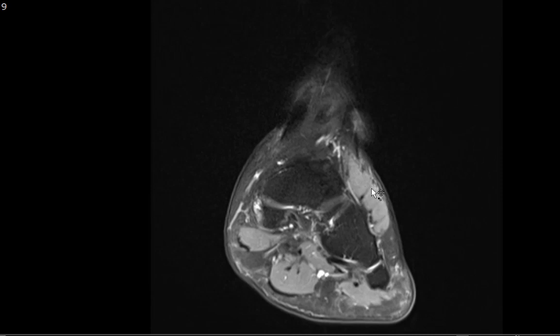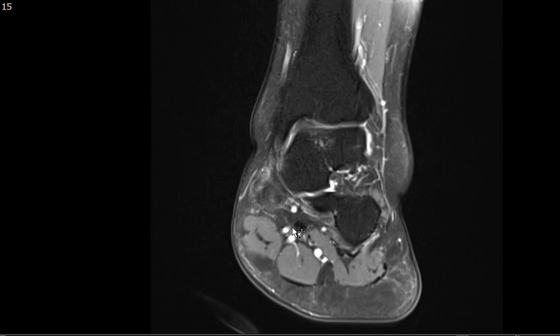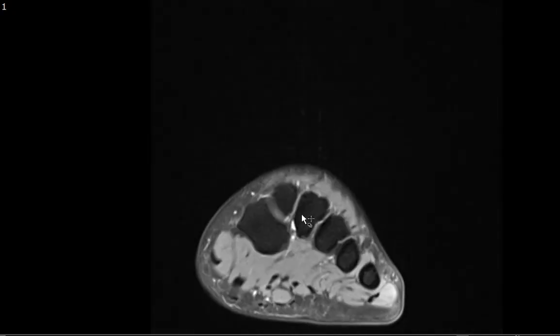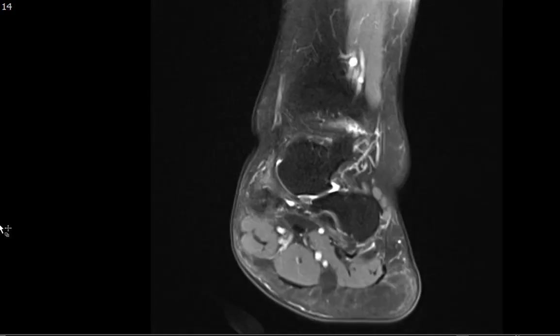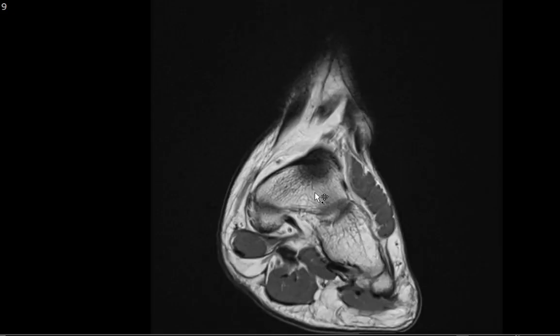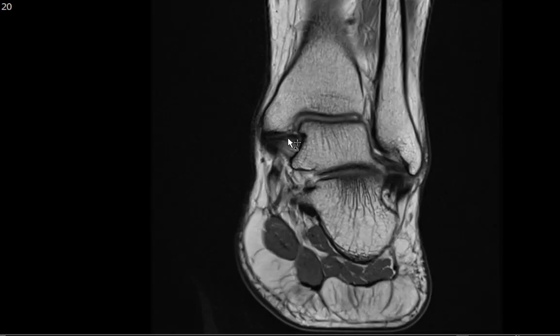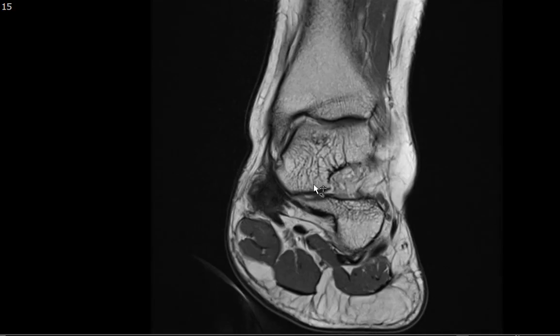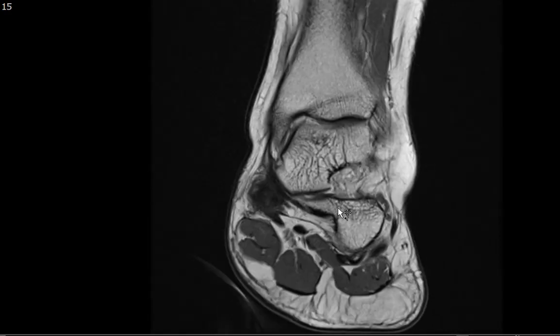On the coronal images you're also seeing the extensor digitorum brevis muscle, the quadratus plantae muscle, and part of the tarsal tunnel where the posterior tibial neurovascular bundle runs. I also look at the proton density coronal image to evaluate articular cartilage and confirm there's no osteochondral injury along the talar dome. This gives a beautiful look at the deltoid ligament with its normal striations, and also shows part of the spring ligament.